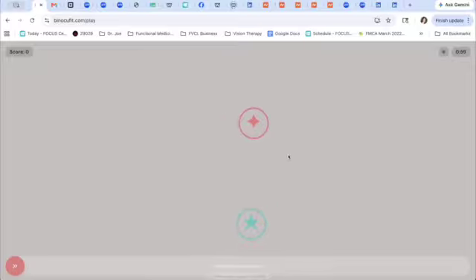All right. So this is the red and green mode. And so I set it on shape. So I have to just simply tap the shape as it's moving, right? I have to tap 3 times because I want to encourage fixation stability, and not just have them be able to be successful in randomly tapping all over the screen and moving on to the next screen. So with this one, if you were working with a child, you would try to have them identify the shape. So it's not just like a sit by themselves and do it, especially if you're working with a young child. The most therapeutic benefit is going to come when you collaborate with the therapist or a parent.